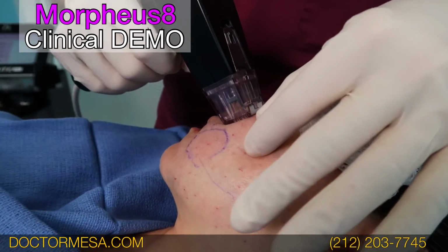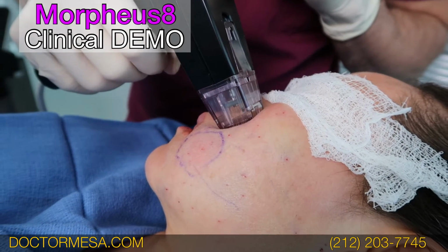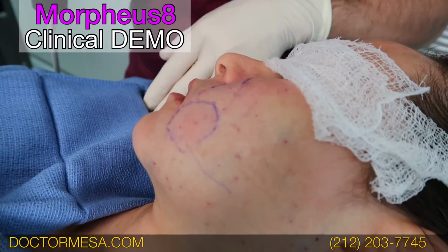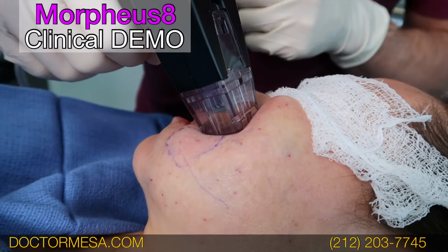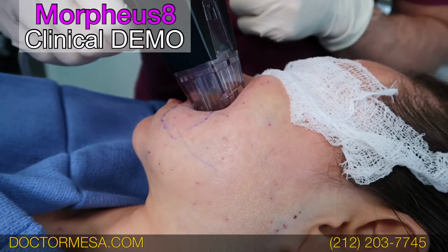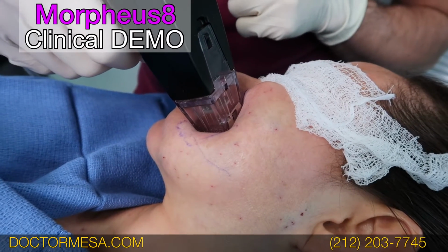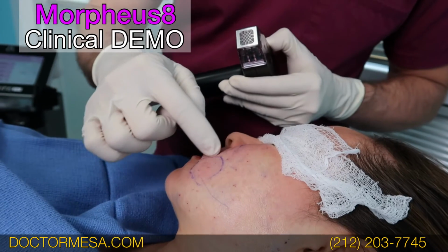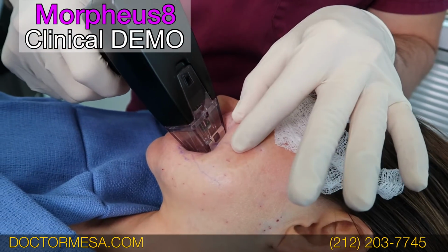So we're going to go here, press, and you see? Do you have any discomfort? No. Not at all. Excellent. And that's the advantage. We can do it in the office under local anesthesia. So in this area is where I want the reshaping of the fat. So we're gonna go down.